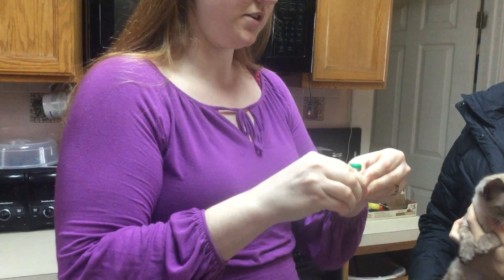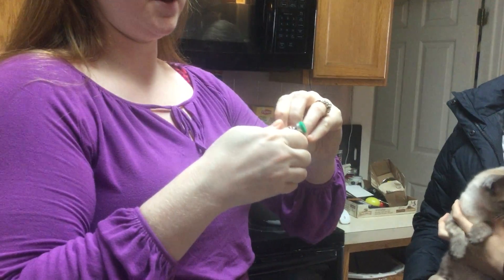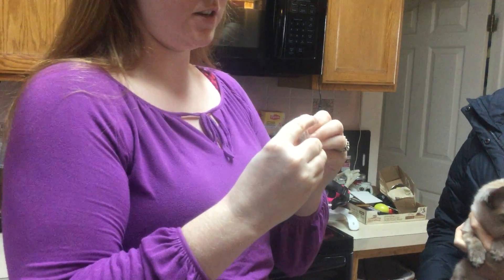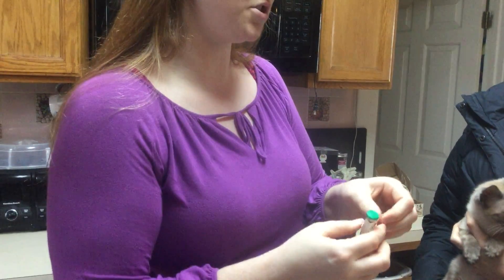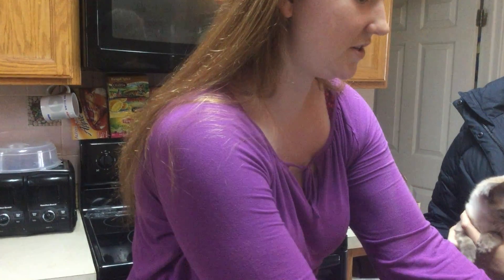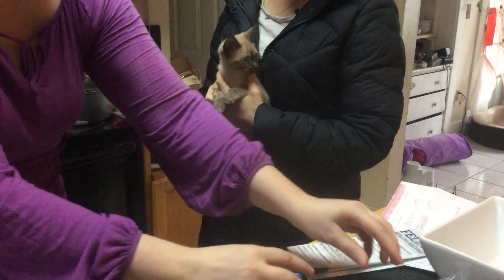I'll take the stickers off so you can see them more clearly. I just love my household full of noise and activity. I send these vaccines home and I rarely give these to my kittens myself because I give the injectable version. Since they're only eight weeks old — this kitten is now 12 weeks old — I'm able to give the intranasal vaccine now.